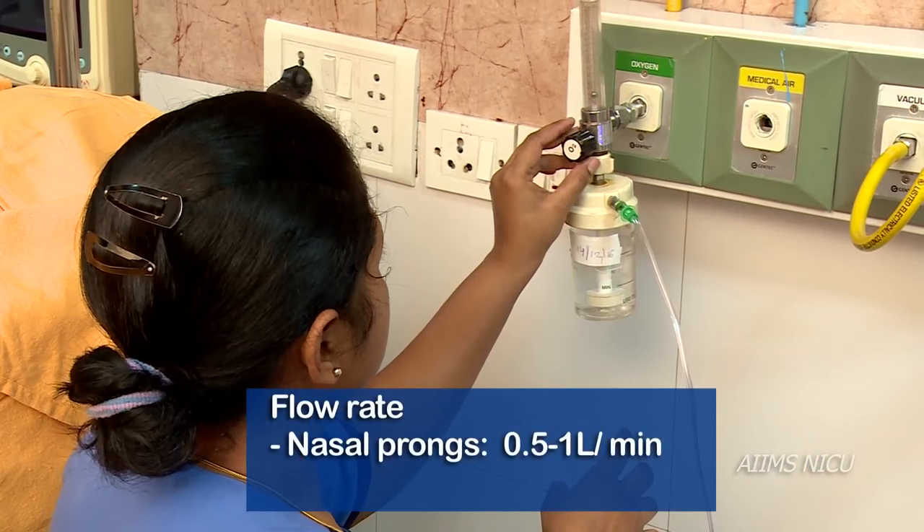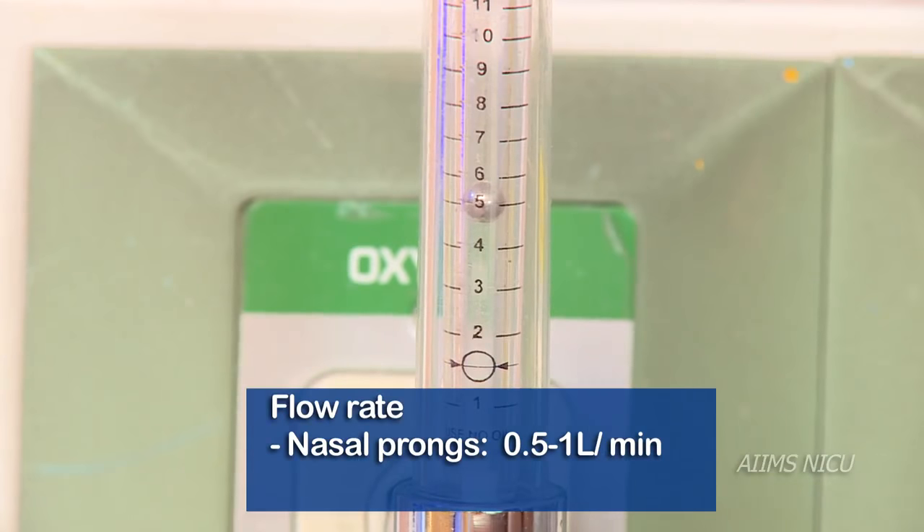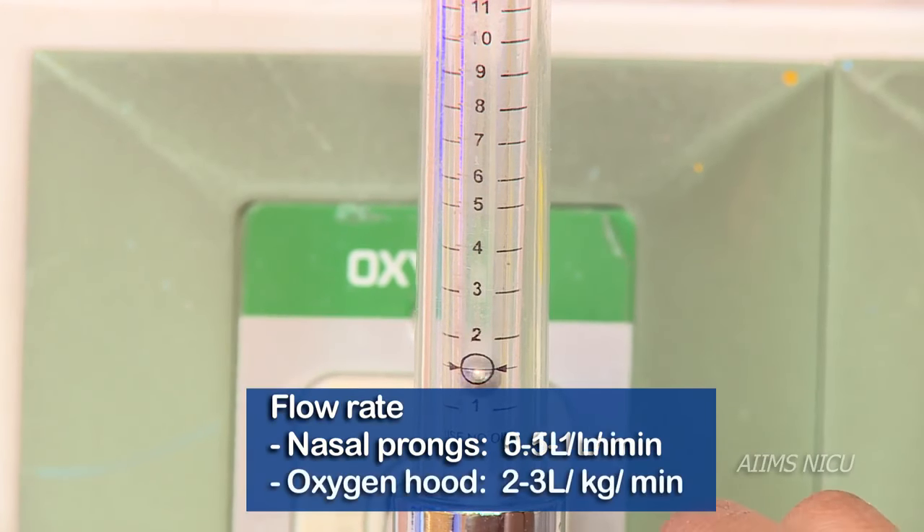The normal oxygen flow rate set for nasal prongs is between 0.5 to 1 liter per minute, and 2 to 3 liters per kg per minute in the case of oxygen hood.